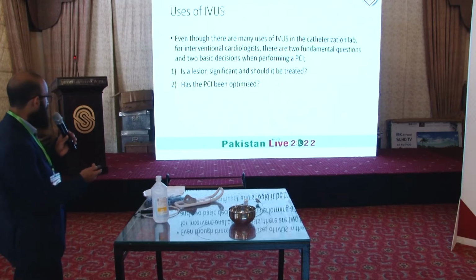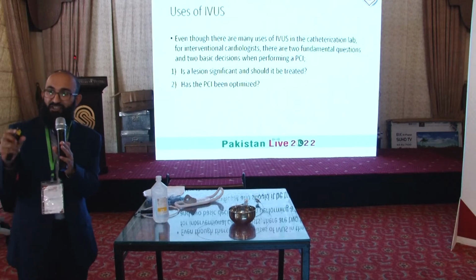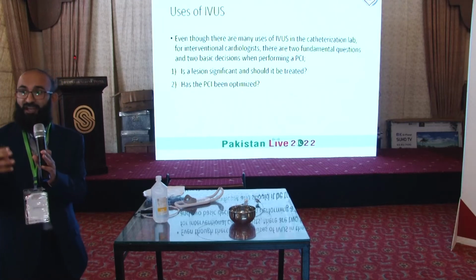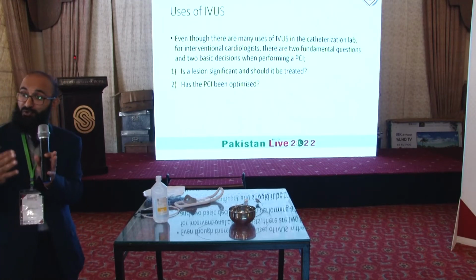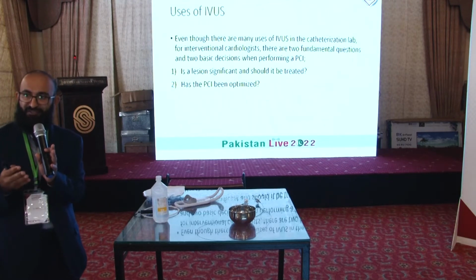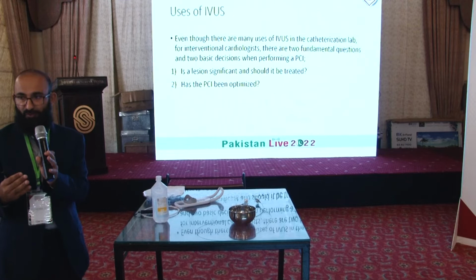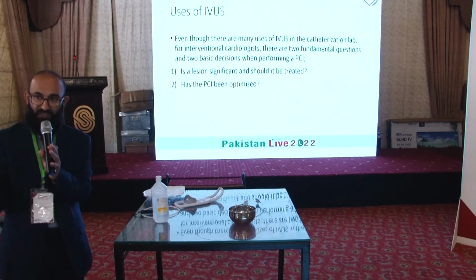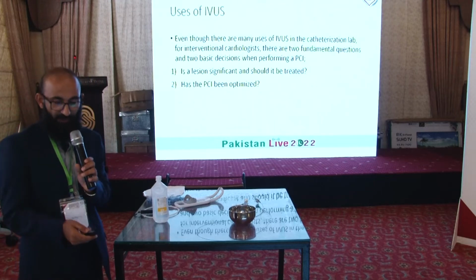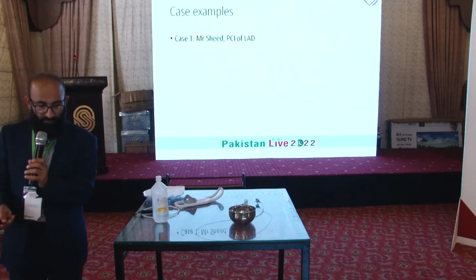And as I have already mentioned, the use of IVUS is very important to plan which diameter of stent you have to take. You can take the length of it very precisely, and diameter, as well as your post-stent dilatation. You can plan that as well, looking into the different distal and proximal reference diameter. And in complex PCI, it's a very important tool for a left main or for calcification. So definitely IVUS has a very key role in optimizing the procedure. So I will switch to the case example.